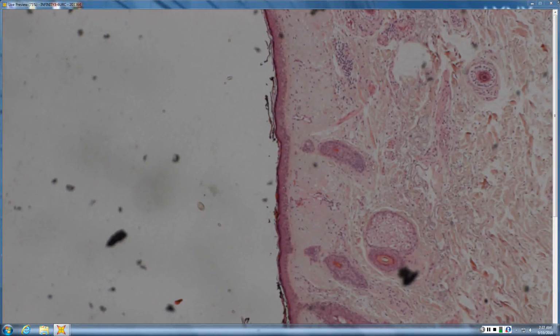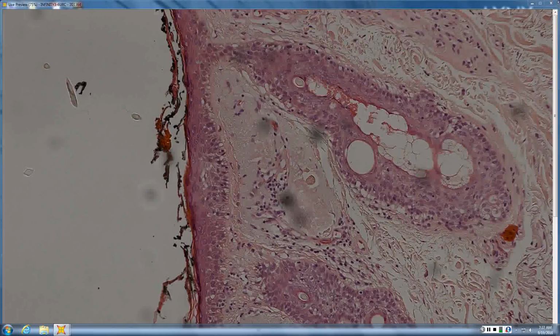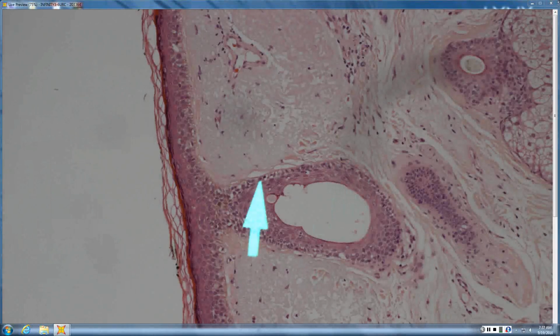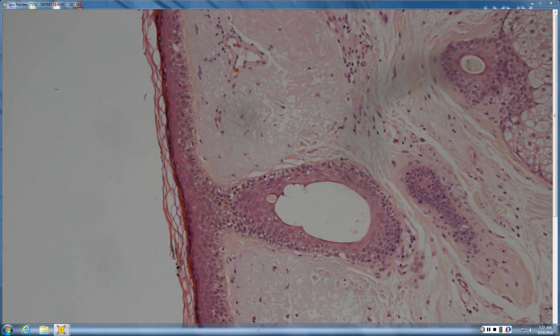Right. It looks like, and this absolutely is, lichenoid regression of some melanoma. There's pigment at the periphery there. We can look down. And if you look here, there's maybe something subtle going on at the junction. The issue with lichenoid regression is immunostains usually don't help you because it's regressed, right?